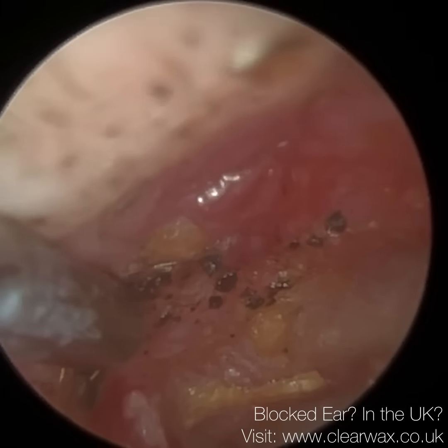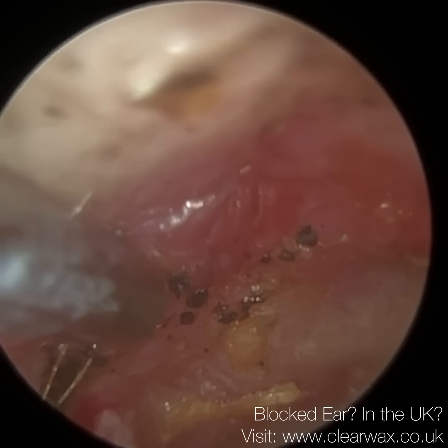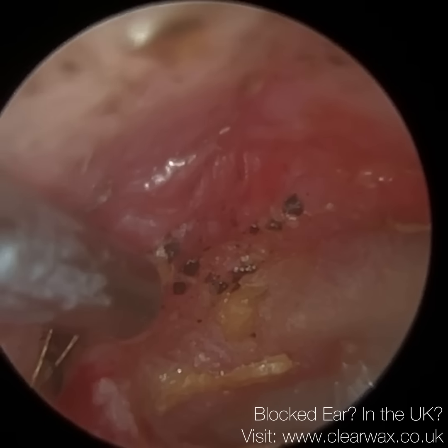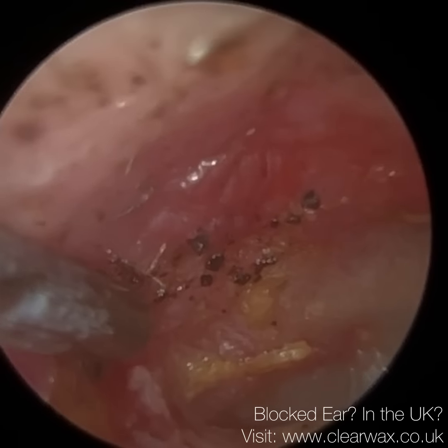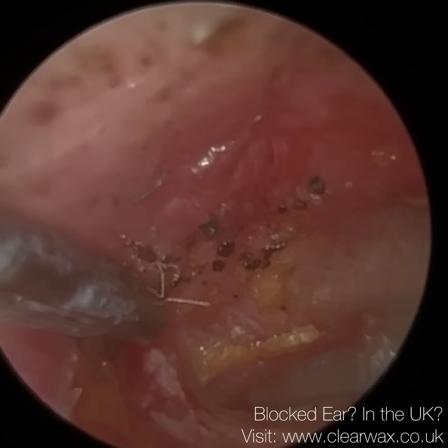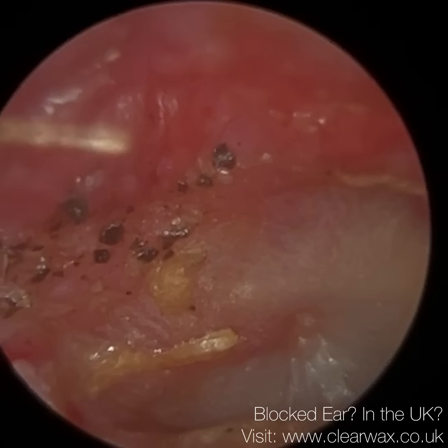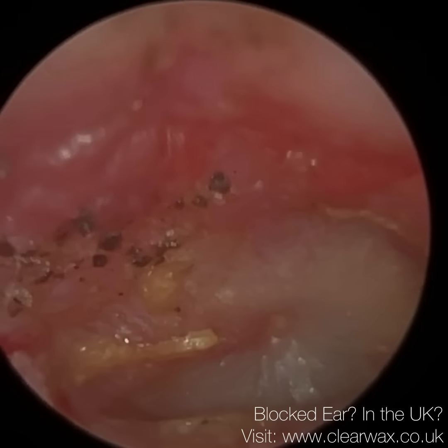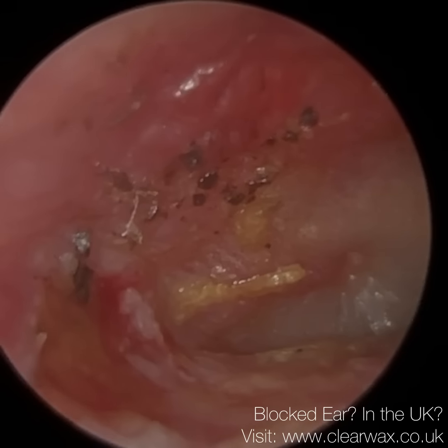Having this skin plug in there is not going to obviously help because it can cause some humidity, some warmth, darkness in the ear, which is the conditions fungi really thrive upon. So it's just been an overgrowth, which then leads to immune reaction, and you can get a bit of inflammation as a result of that. You can see it's quite sore there at 9 o'clock on screen, so I think we just left the procedure at that.